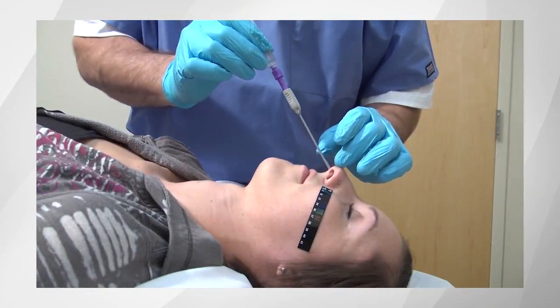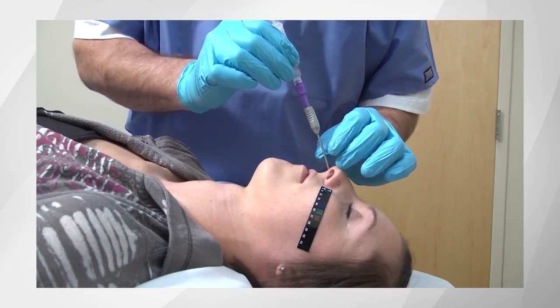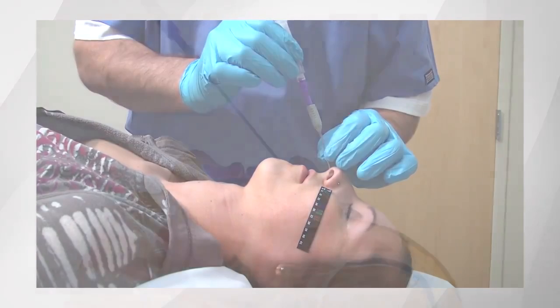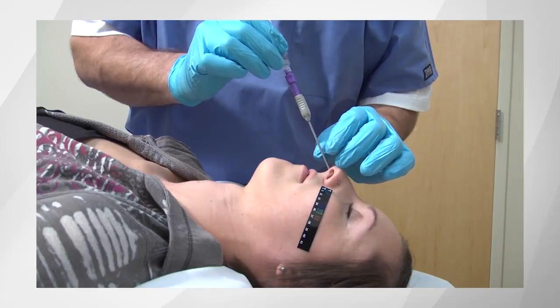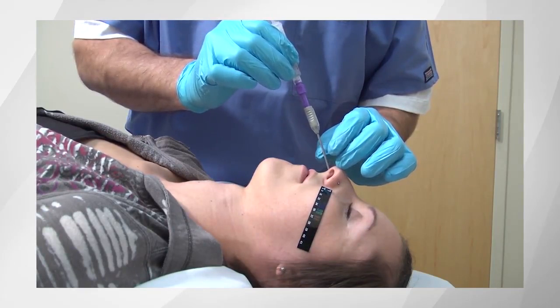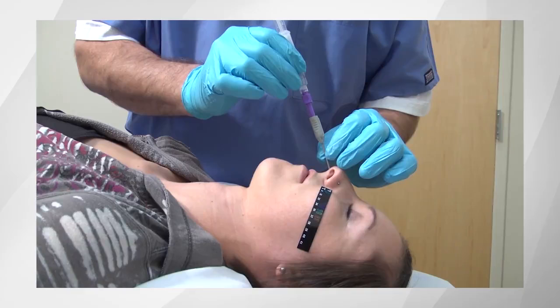Inform the patient that you're going to gently insert the SphenoCath into their nose. With the directional indicator pointed towards the ceiling, the SphenoCath is inserted through the nostril and nares. Using the non-dominant hand as a guide and anchor is very helpful. Gently place the tip of the middle finger on the tip of the nose and let the catheter glide between the tips of the thumb and forefinger. Advance the catheter gently toward the bridge of the nose.